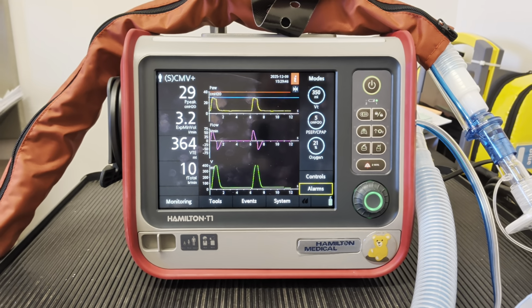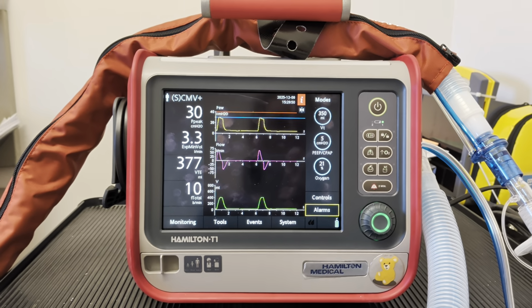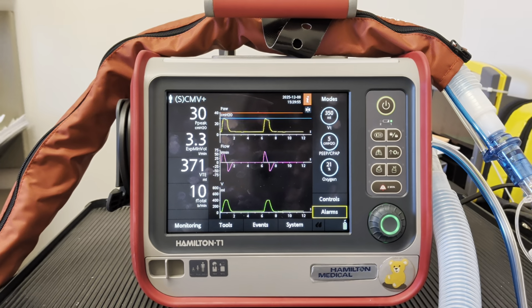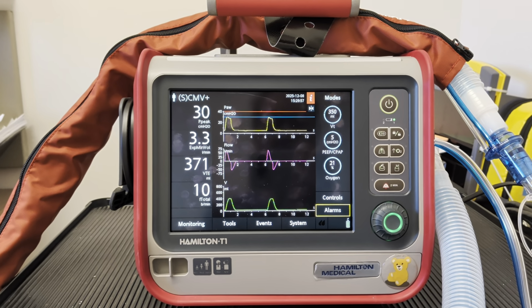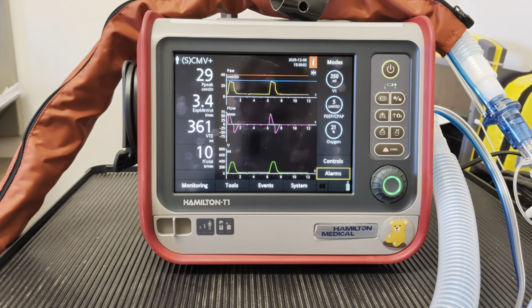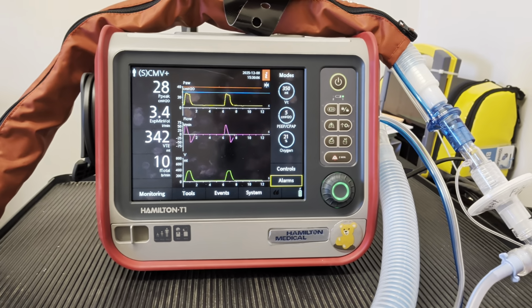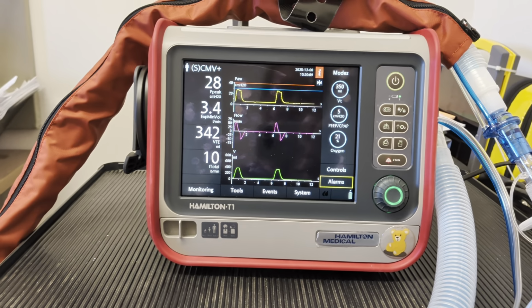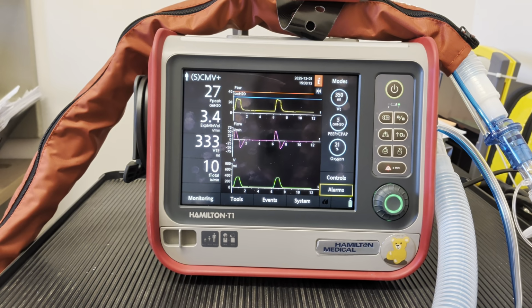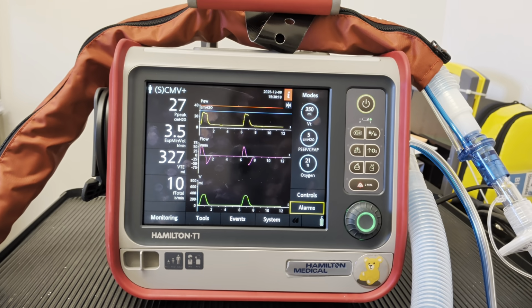Don't forget that you should always have a bag valve mask with not only the 15 millimeter adapter, but with a mask that you can seal over the patient's face in the event that you have a critical failure and you need to attach the BVM to an artificial airway, or perhaps pull the artificial airway and provide rescue ventilations through the BVM. The BVM should always be readily available to use as your backup ventilatory device.